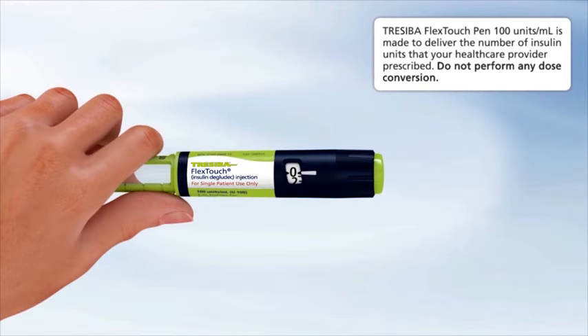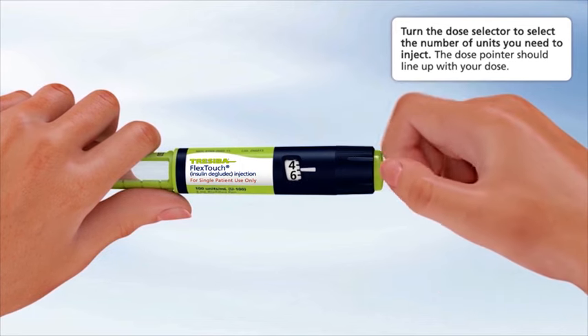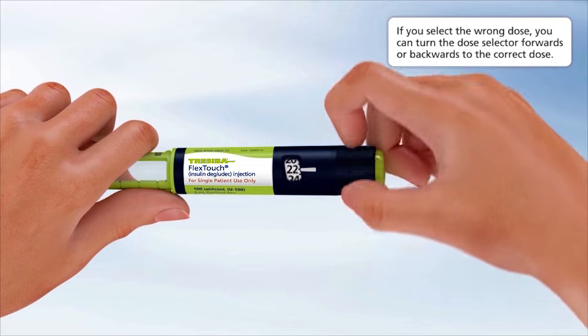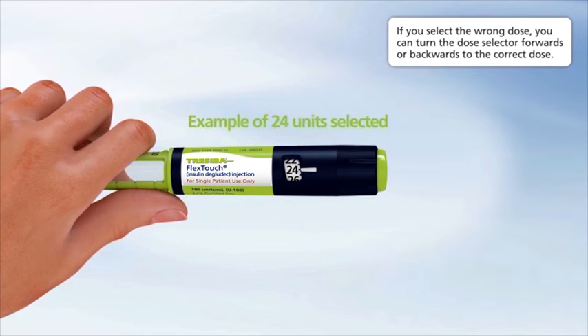Selecting your dose: Traceeba FlexTouch Pen 100 units per milliliter is made to deliver the number of insulin units that your healthcare provider prescribed. Do not perform any dose conversion. Check to make sure the dose selector is set at zero. Turn the dose selector to select the number of units you need to inject; the dose pointer should line up with your dose. In this example, five units are selected. If you select the wrong dose, you can turn the dose selector forwards or backwards to the correct dose. In this example, 24 units are selected.